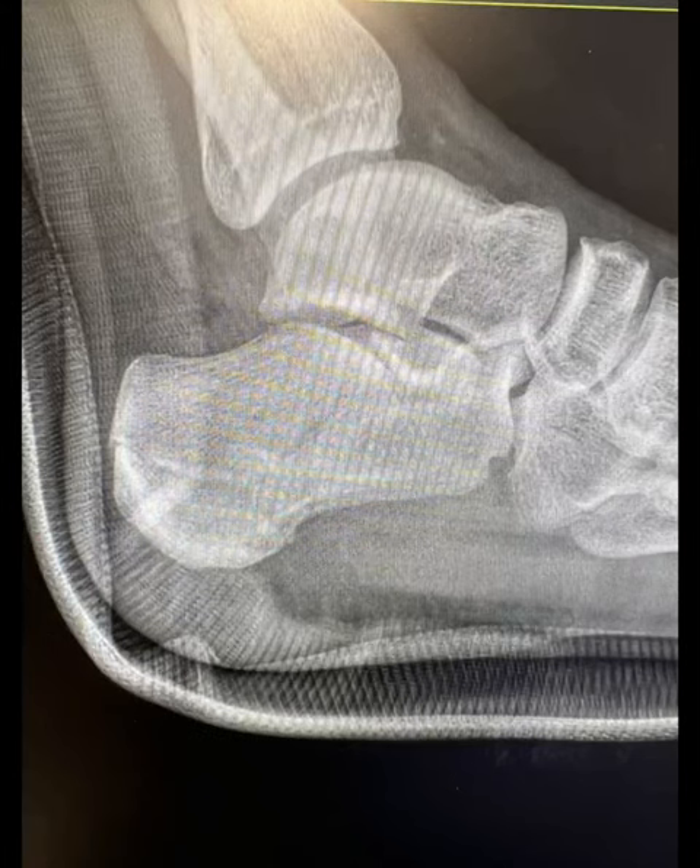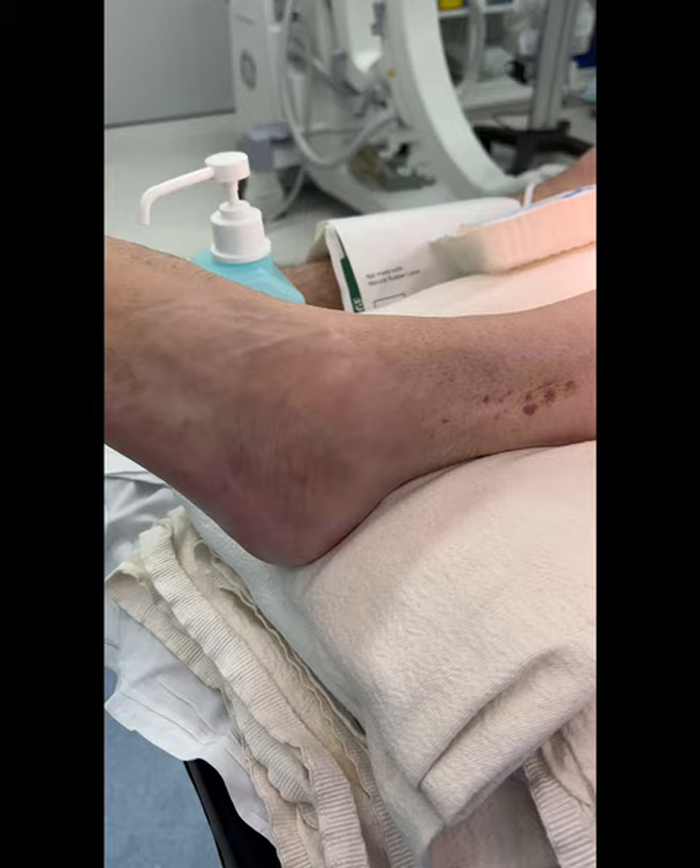Here I'm going to walk you through my approach to this fracture via sinus tarsi approach. So we're going to do a sinus tarsi approach.